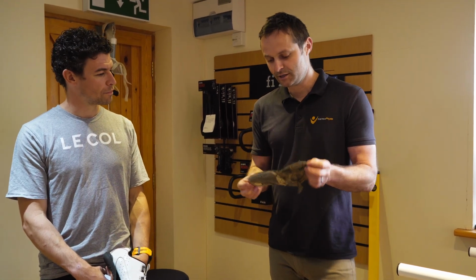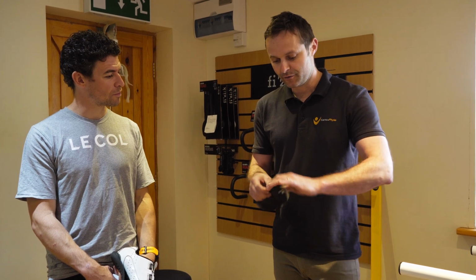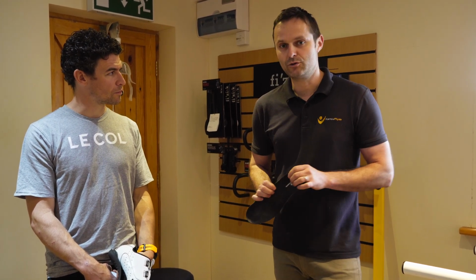So we're going to replace them with these Sidas footbeds. The carbon fibre is going to be nice and strong, and it's going to keep your ankle nice and neutral.